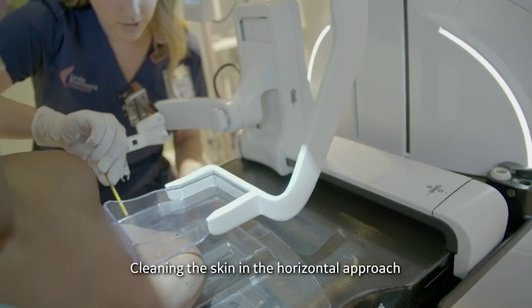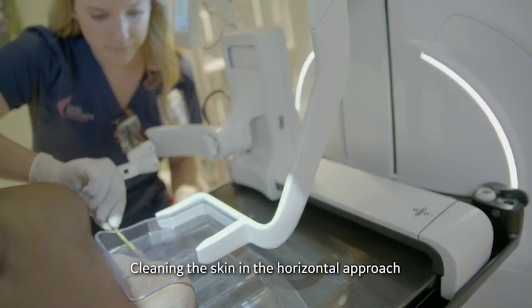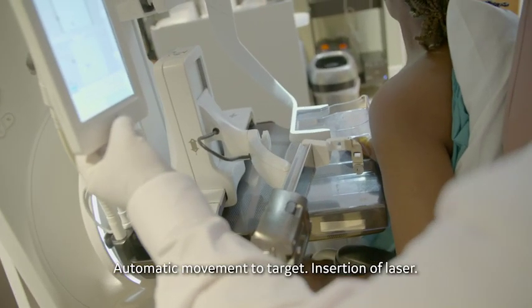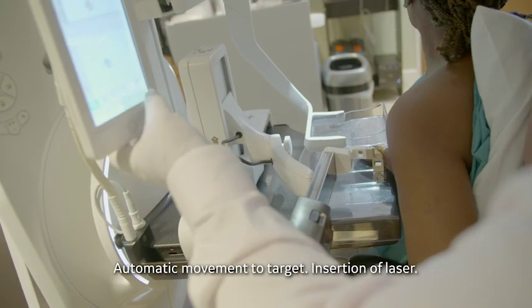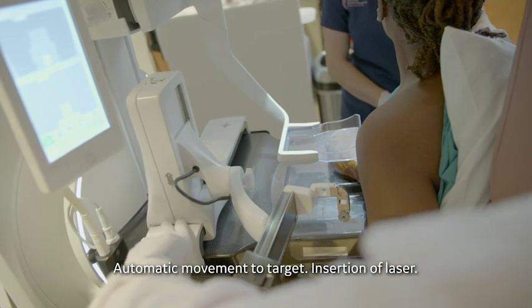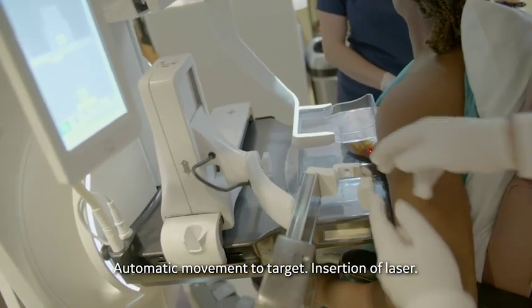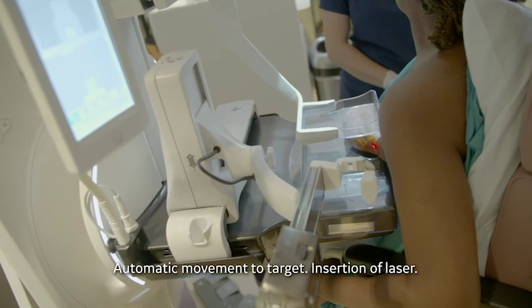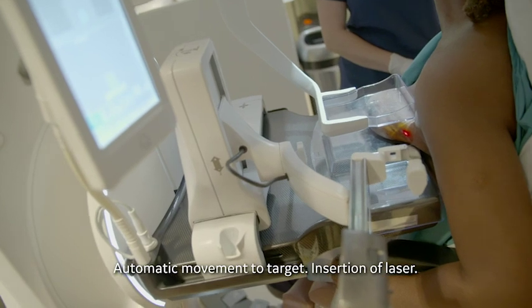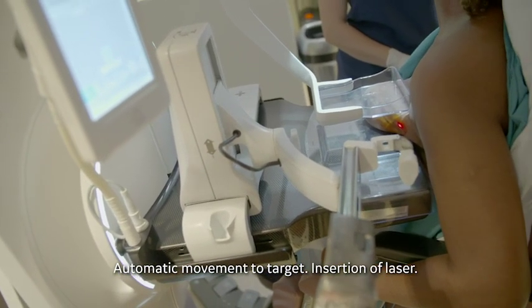The technologist cleans the skin where the needle will be inserted. The radiologist drives Serena to the target location and moves the needle to needle max, again to maximize his workspace. The laser is inserted to give an accurate location where the needle will enter the breast, and he uses this laser to indicate where to insert the anesthesia.